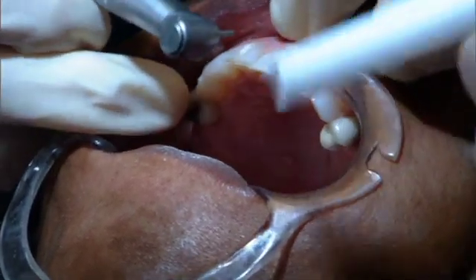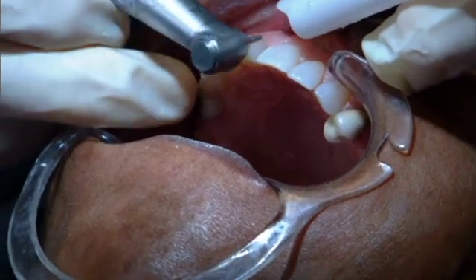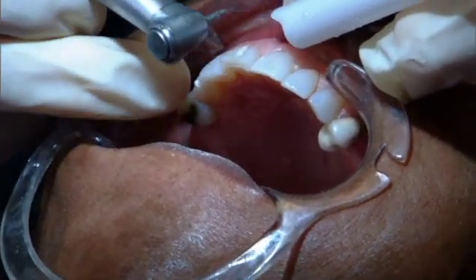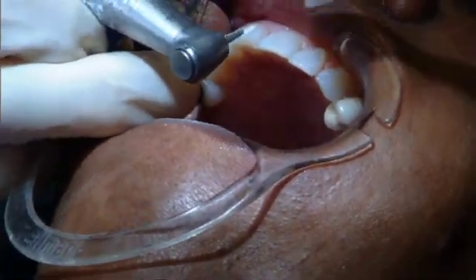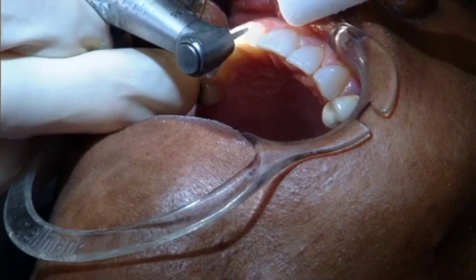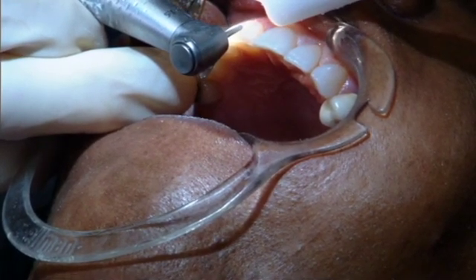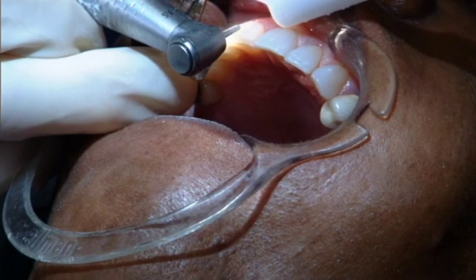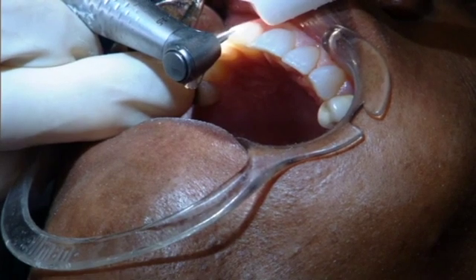Now, when I was in dental school, we were taught to prepare the gingival first and then come back and do the incisal. Over the years, I've learned that to provide as much room as I can for the laboratory, I'm going to do the incisal reduction first, using the tip of that burr as a guide or a depth guide.